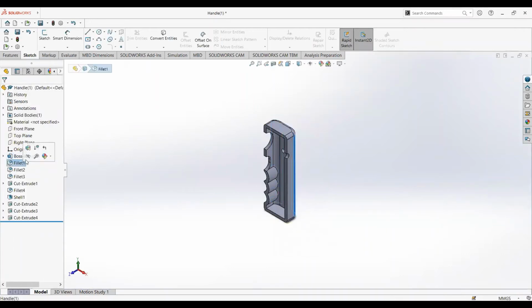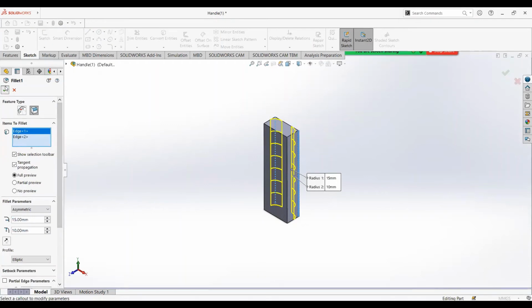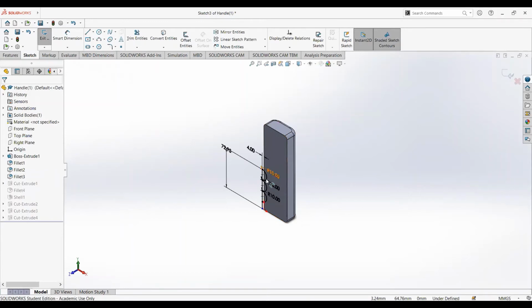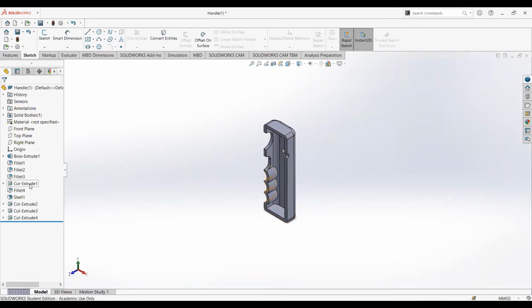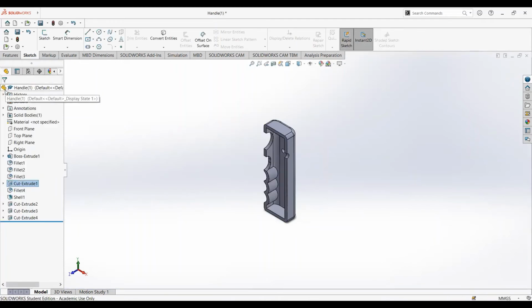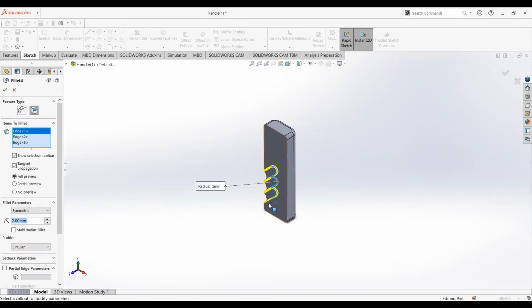After that, we used fillet, so there's no sharp edges. We use fillet here, here, and then the bottom as well, so there's no sharp edges, and it'll be comfortable to hold for our customer. And then we sketch this part, and then we're going to cut extrude that part, as you can see right here. This was done to give our device an ergonomic grip and to create a comfortable grip for our customer. After that, we used fillet, so there's no sharp edges.